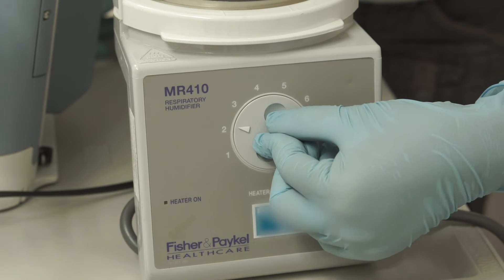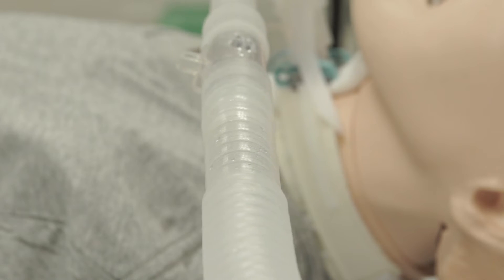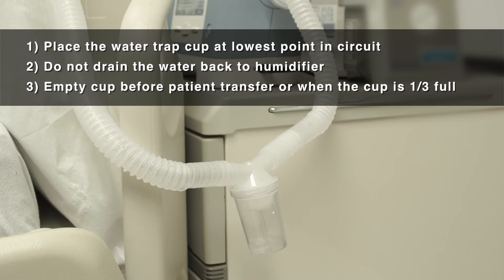Temperature can be adjusted according to the thickness of secretion. There should be visible tiny drops collected on the inner surface of the tube. Place the water trap cup at the lowest point in the circuit so that water will drain into it. Do not drain the water back to the humidifier.